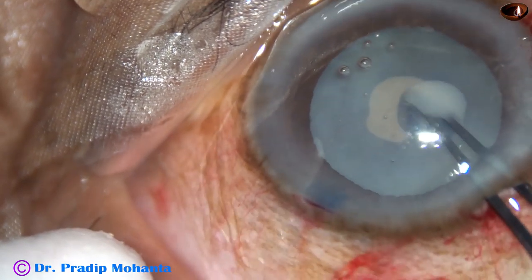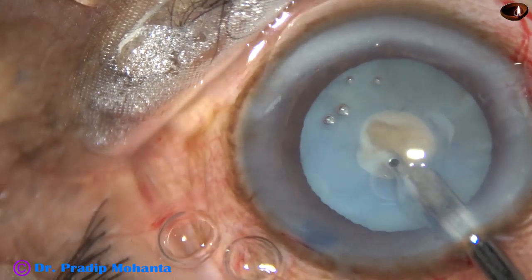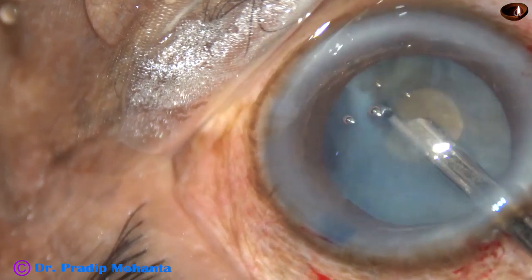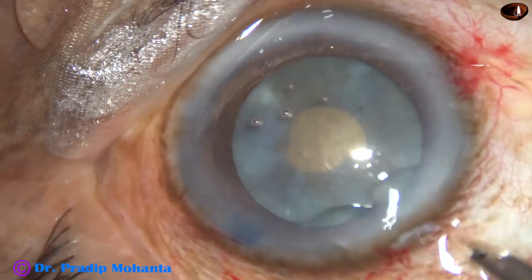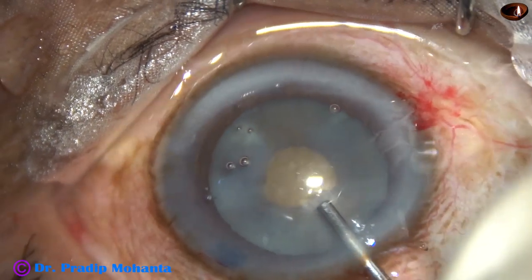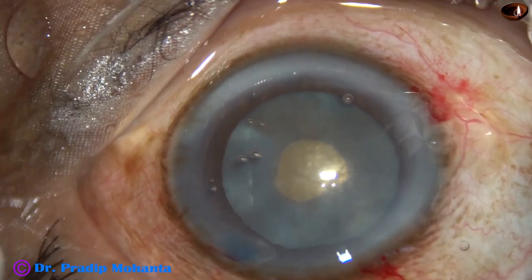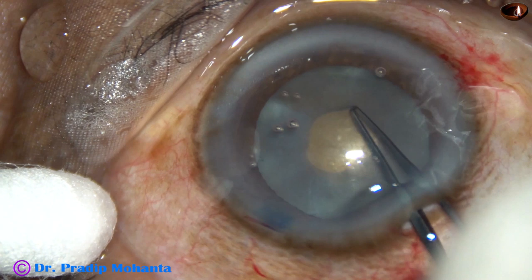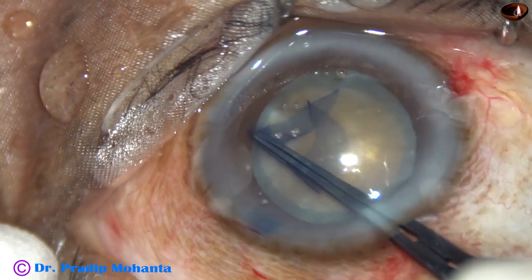This milky fluid indicates it is a hypermature Morgagnian cataract. Some milky fluid is aspirated by a 23G Simcoe cannula. The intralenticular pressure is reduced. Visco is injected. A small cut is made at the margin of this small rhexis and the Utrata forceps is used to enlarge this small rhexis into an optimum-sized rhexis.